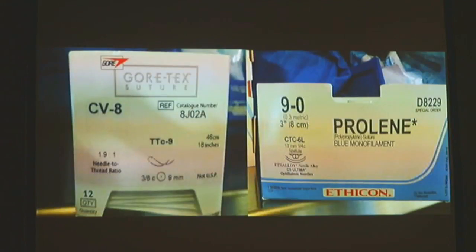And of course, we spoke earlier that when we suture these devices in, we like to use a more durable suture. Gore-Tex has been used for many years by the cardiovascular surgeons and by us. And this particular model, CV8, is the smallest bore suture, 7.0 Gore-Tex.